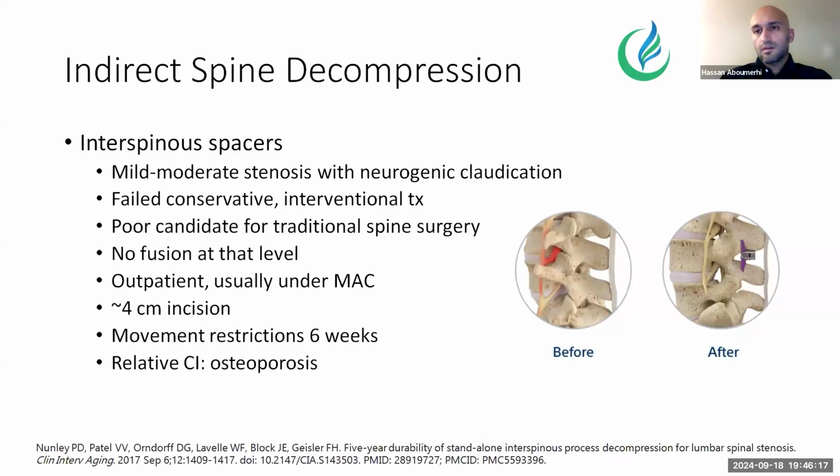Now, this is a different type of intervention for stenosis, here requiring an implant. With interspinous spacers, the concept is that by placing an implant in between the spinous processes, you're able to indirectly decompress the spine, or open up the canal, as well as the lateral recesses and the neuroforamina, without having to do a traditional spine surgery or remove large pieces of bone or having the patient endure a significant amount of recovery afterwards.